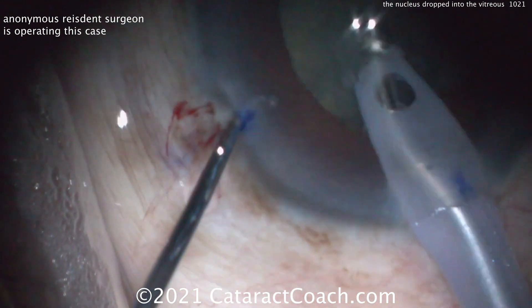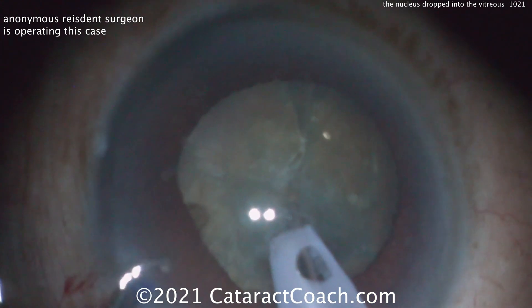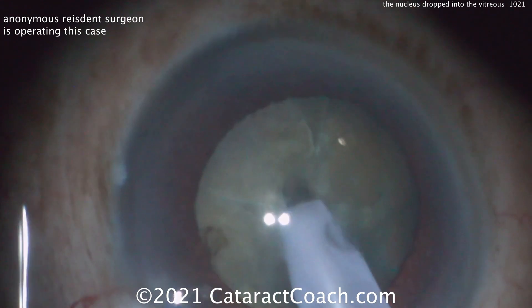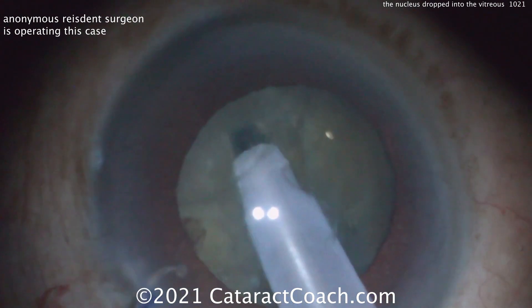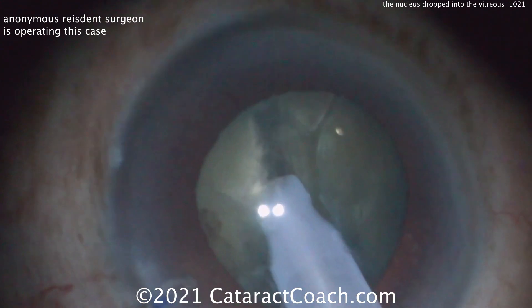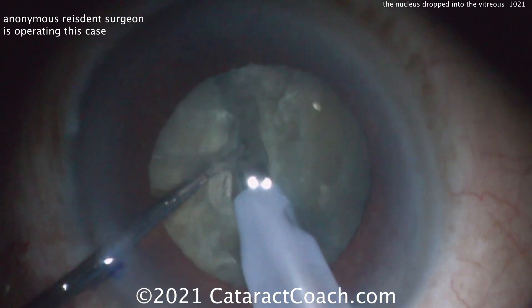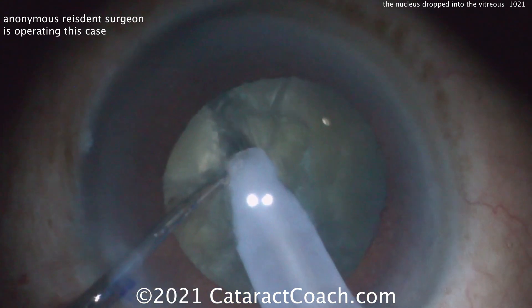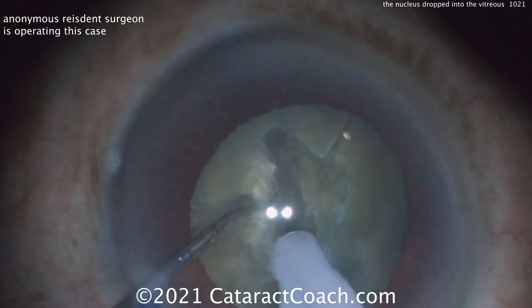Let's get the Faco probe in the eye and see what's going to happen here. A sculpt down the middle — sculpting a groove. The radialized area is right under the Faco probe in the sub-incisional area. Now you're grooving and you're going to use the two instruments to crack or separate those two nuclear halves. What's the direction of the force that you're placing on the capsule? This maneuver right there is causing that radialized area to run, zip through the posterior capsule.